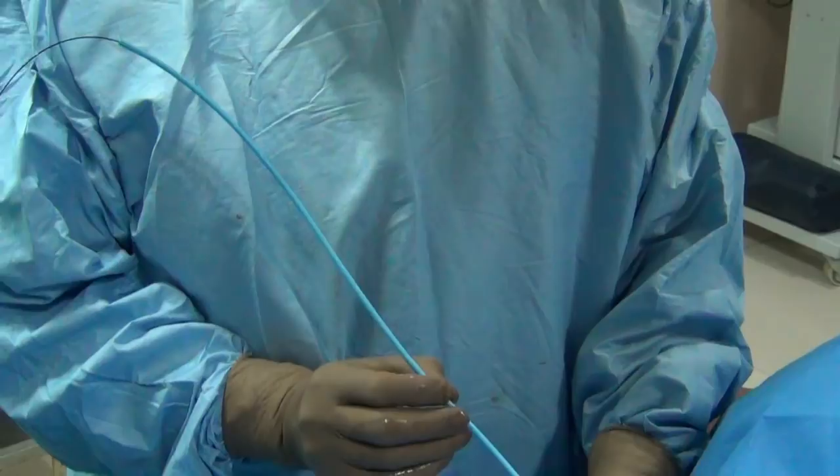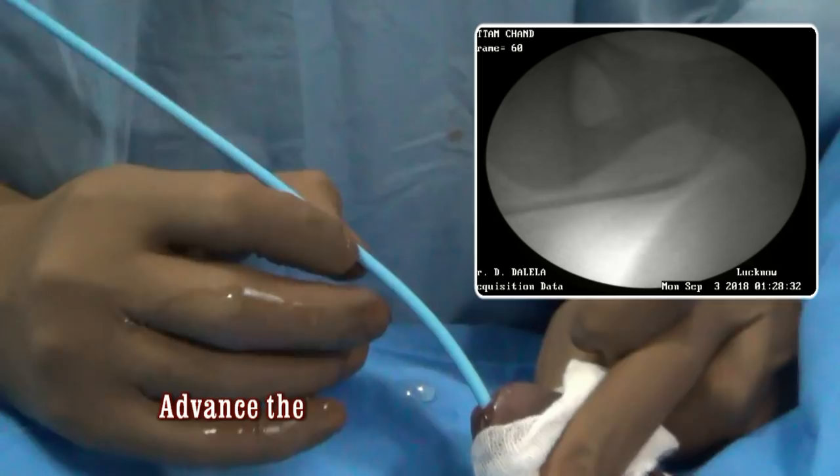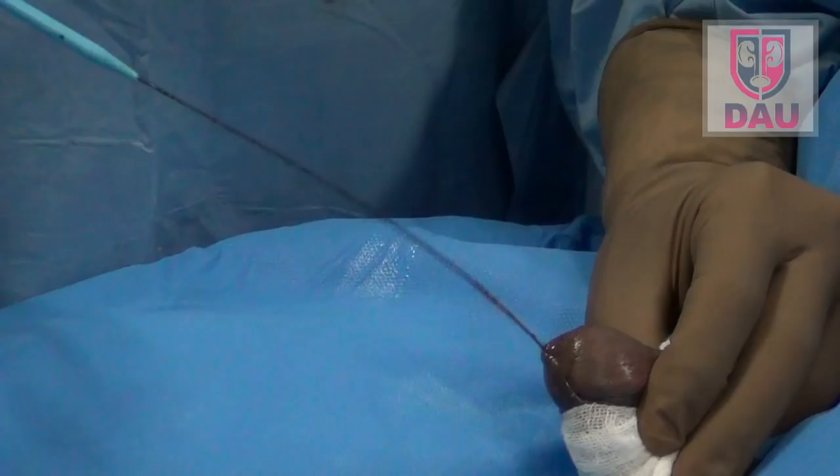Initial dilators usually go easily. You must remember to be very gentle and very slow, and you can watch the entry of the dilator into the bladder on fluoroscopy. Having done that, withdraw the dilator and every time the dilator comes out, look for any blood on the dilator or blood coming out of the meatus.